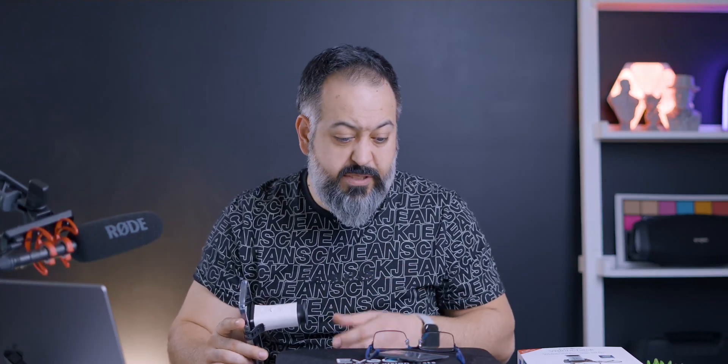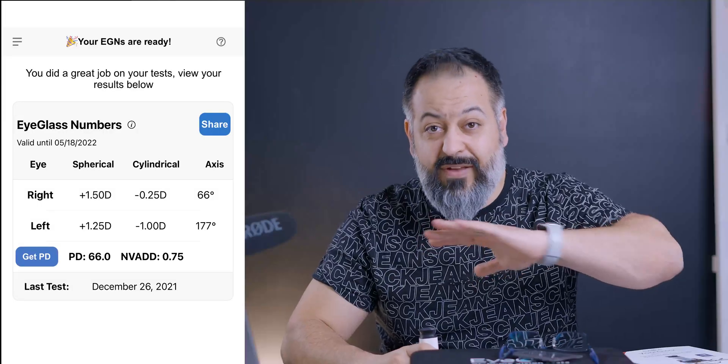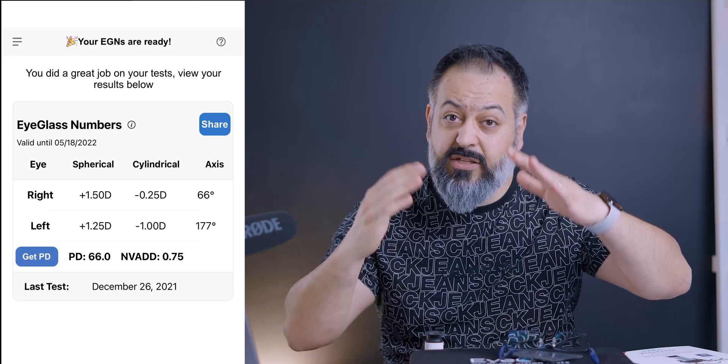Once you finish three test cycles for each eye, it gives you the option to test again or end it. You end it and it gives you your eyeglass numbers — everything you need except your PD measurement. For PD, you put on the white frames and take a selfie through a guided part of the app. It detects the center of your eyeballs and the frame markings, and gives you a measurement. Then you have everything you need to order your glasses.